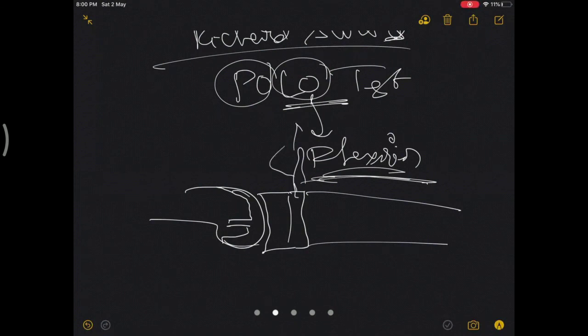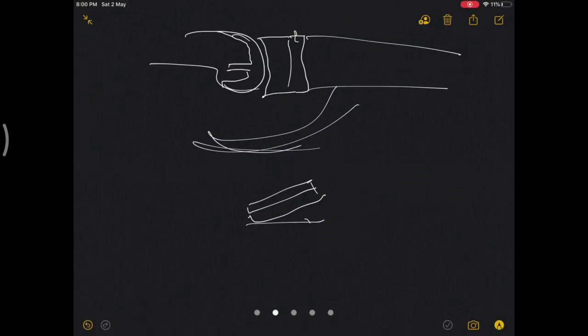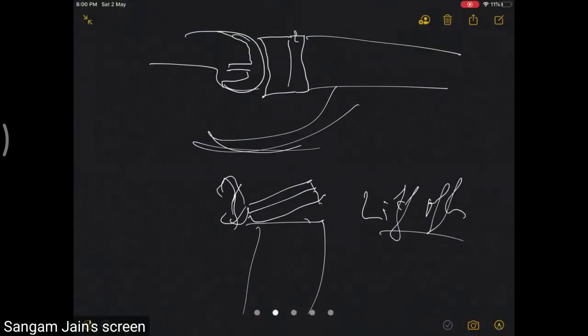You put in a trial poly, and you implant the femur, and then you take this through the range of motion, and on flexion, if you observe a lift of this base plate or poly, that means the flexion gap is tight. This is lift off: lifting of this tibial poly because of the tight flexion. So this tells there is a flexion tightness.